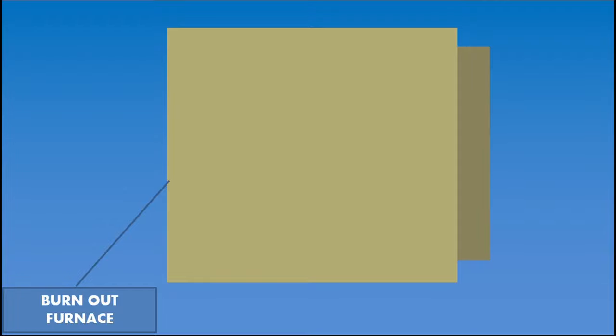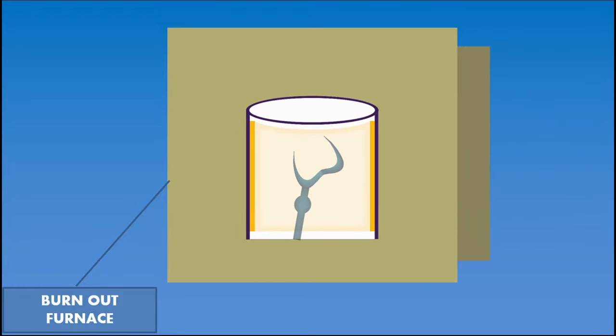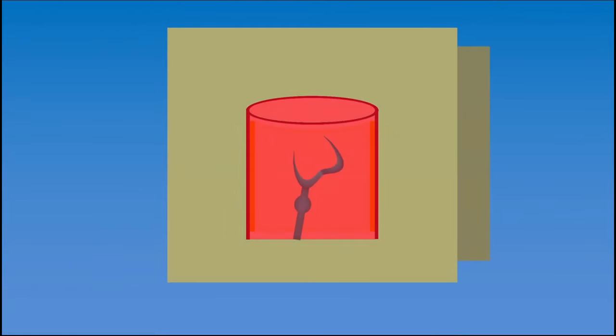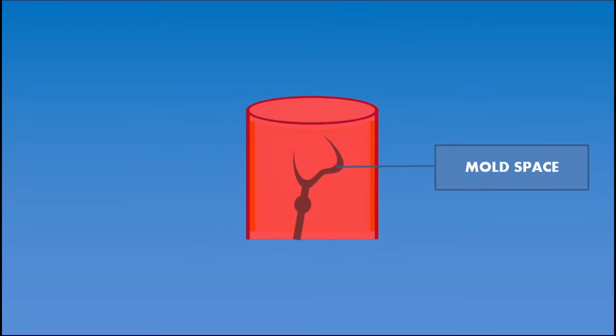Once the investment is completely set, the crucible former is removed. This complete setup is taken to a burnout furnace. The burnout furnace acts as a heat source and warms up the entire setup of casting ring and investment. Once a higher temperature is reached inside the burnout furnace, the wax pattern will get molten and the wax gets evaporated through the sprue space. This procedure of wax elimination is called wax burnout.